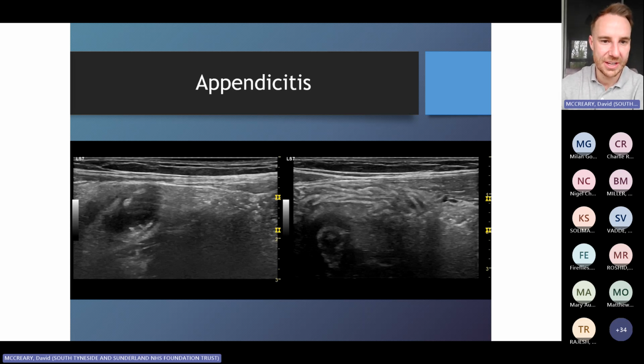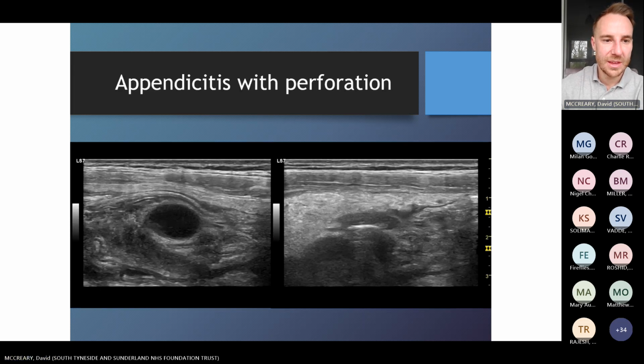None of that should be there. You've got a lot of echogenic material around it. Again, echogenic fat. Hard to make out exactly what we're seeing in this plane, but I would probably say we've got, let's have another look, probably wall of appendix there, possibly compressed by an adjacent loop with free fluid or localized free fluid. Let's have a look at this one. Just all grossly abnormal. I can't explain enough to you how unusual all of this is.